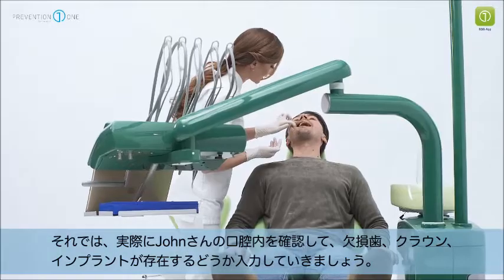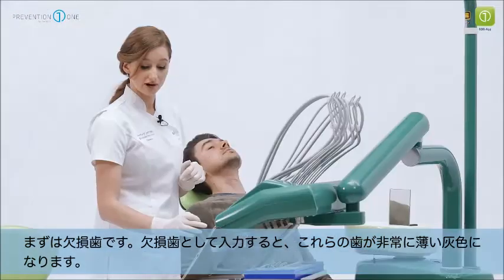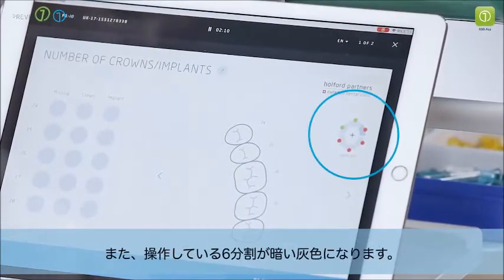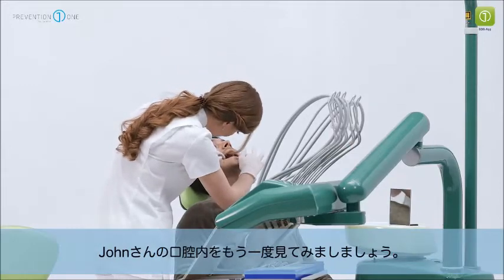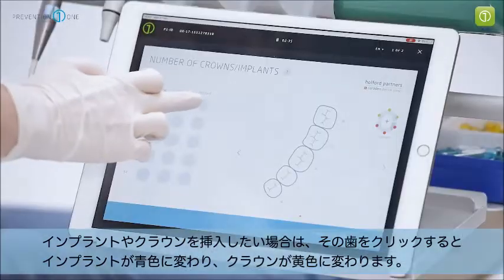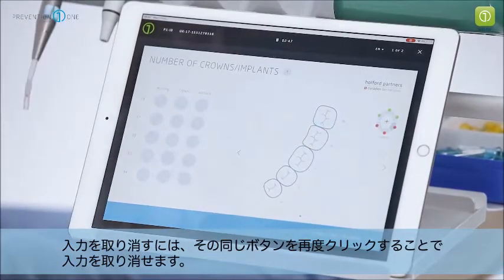Let's have a look John to see if you have any missing teeth, crowns or implants. By clicking the missing teeth they go to a very faint grey colour. Moving on, we can click or swipe to the next sextant, and the top right corner indicator will show which sextant you are working on in dark grey. John doesn't have any implants or crowns, however if we want to place an implant or crown by clicking on the tooth area, the implant turns blue and a crown turns yellow. To remove anything you would just re-click those buttons.